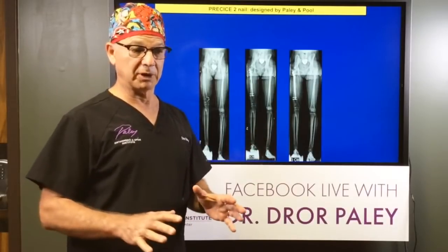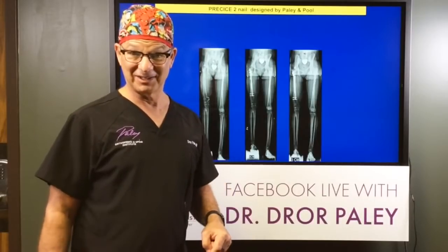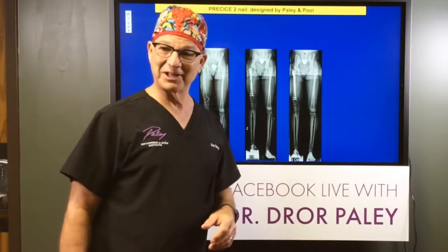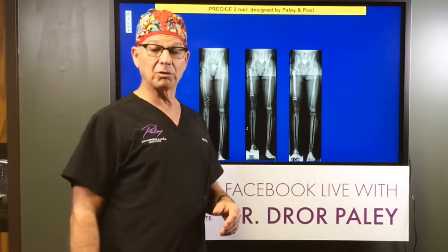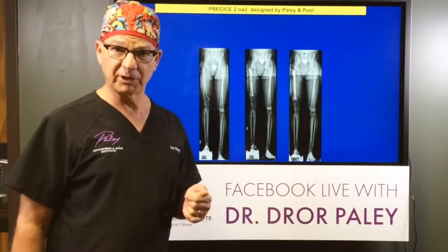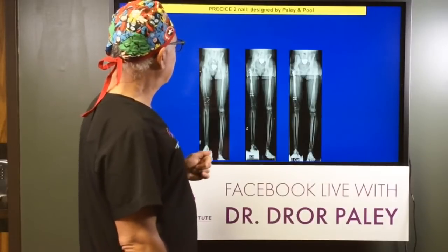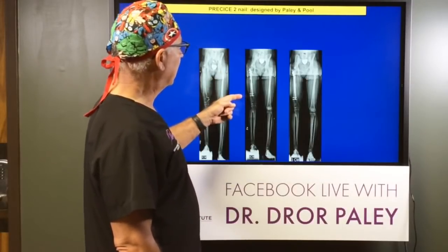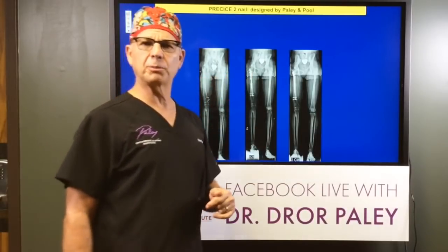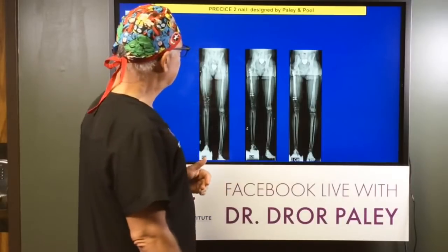One of the things that has now become much more in demand is stature lengthening, not just for patients with dwarfism and low stature, but patients with normal stature who desire height increase. So that is one of the things that's done with these internal devices. You can see lengthening with these internal devices. This was lengthening of more than 4 inches, 10.7 centimeters, of both bones, femurs and tibias.